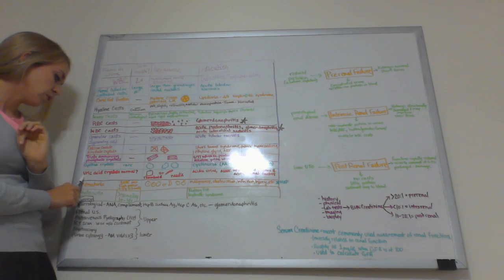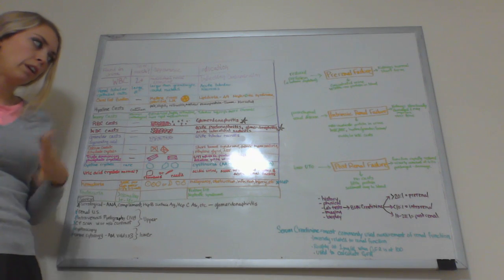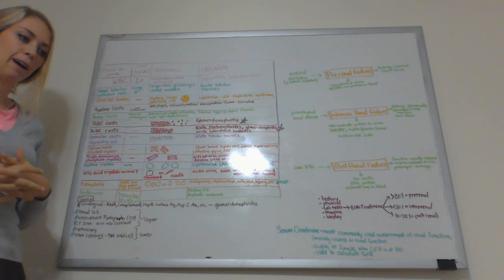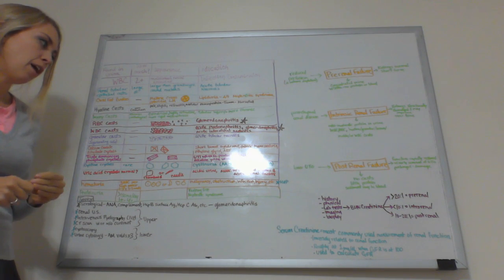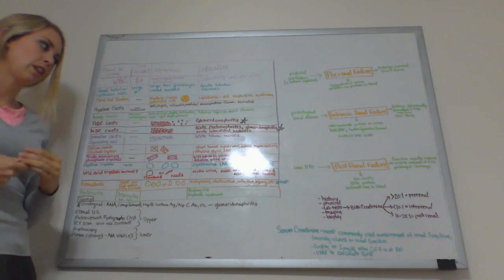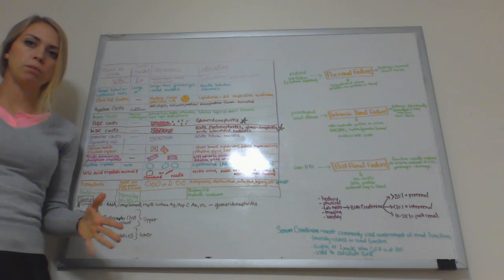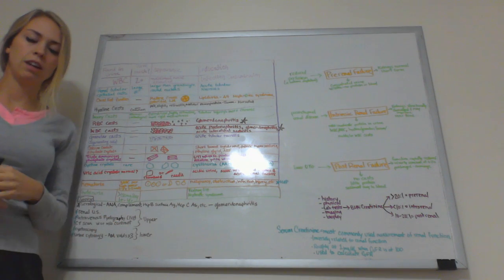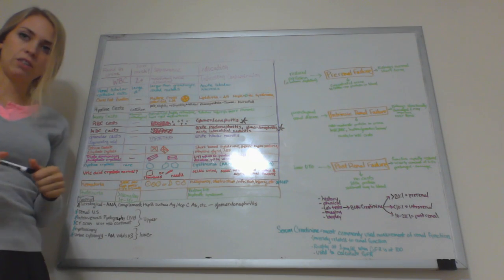Now we're going on to uric acid crystals. They can be normal if you have a very acidic urine. They tend to form. And they're associated with uric acid stones and acute renal failure, so then it would not be normal. So they have different forms in the urine. They can have a rhomboid appearance or a needle-like appearance, and that's the uric acid crystals.